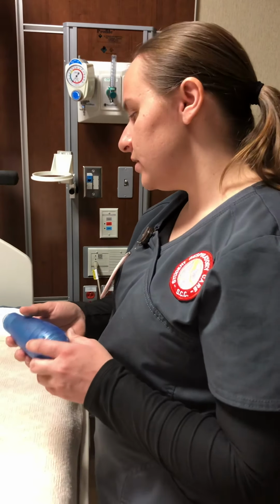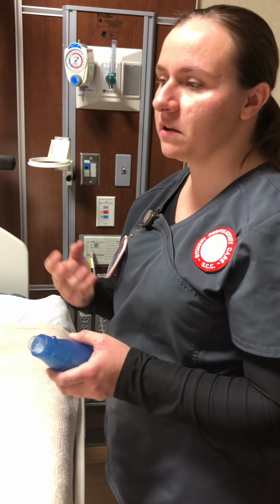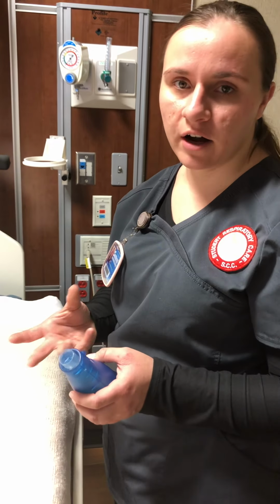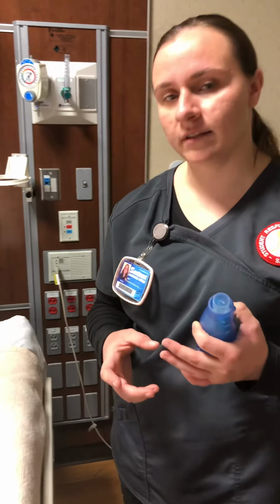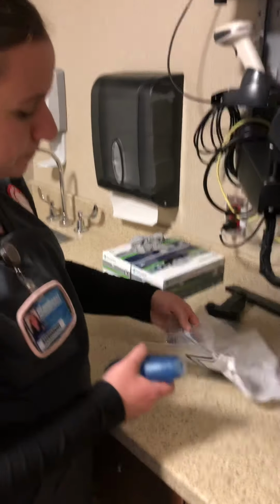So when we are done with this, I am always going to check to make sure the patients are okay. And if they do cough up something, I need to make sure I know the consistency of what it is, the color of it, if it has any smell, anything like that that comes with the sputum that they may cough up. And so I'm going to place this in the appropriate bag.